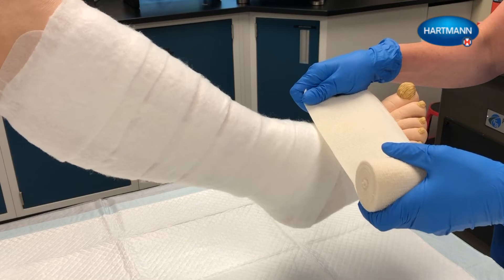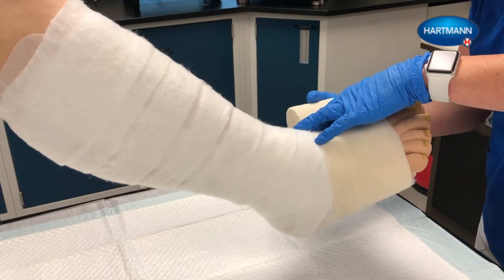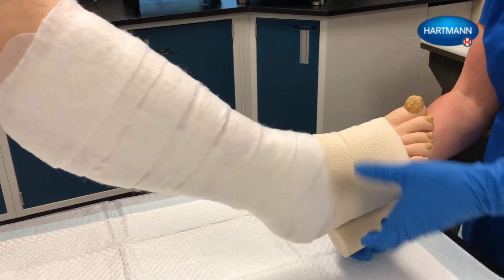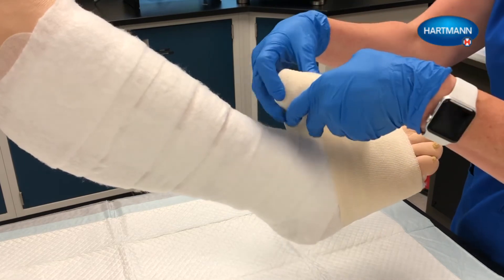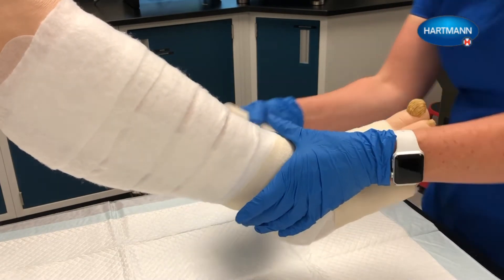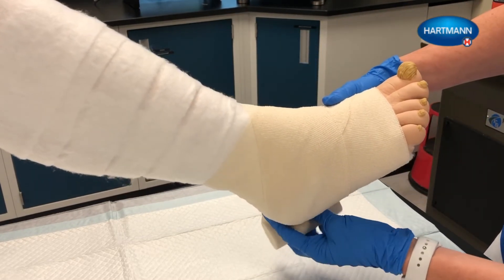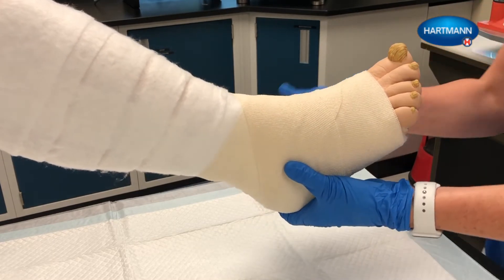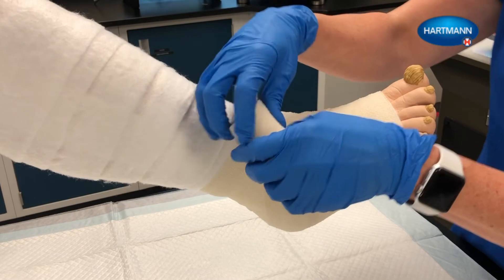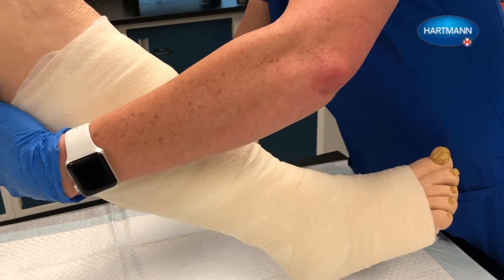Layer 2 is the crepe bandage. Using the same spiral bandaging technique as for layer 1, start applying the bandage proximal to the base of the toes. After two turns for fixation, wrap the bandage across the back of the foot and then enclose the heel. Using a spiral technique with 50% overlap, continue to wrap the leg to just below the knee. Smooth the bandage after each turn. Cut off any excess bandage and secure the end of the padding layer with one of the tape strips provided.